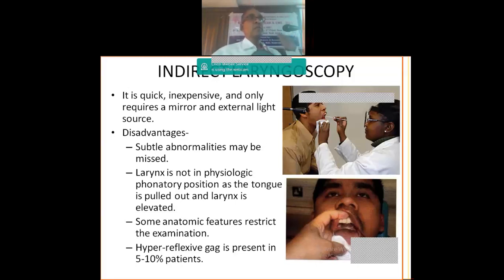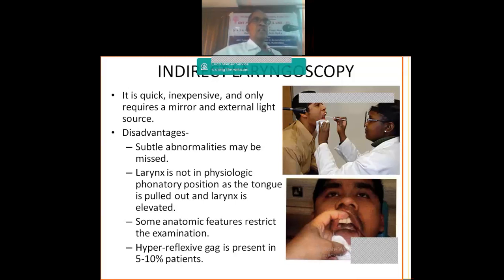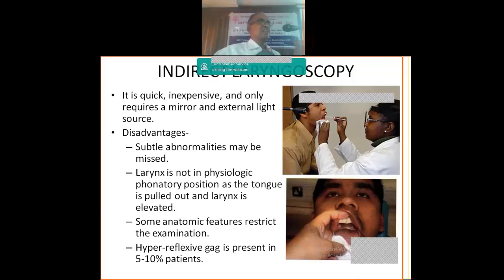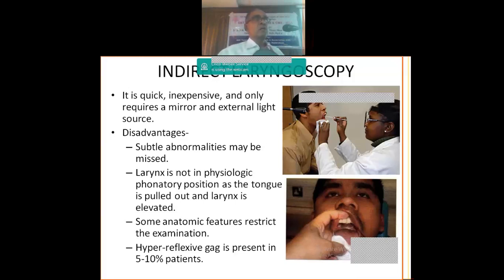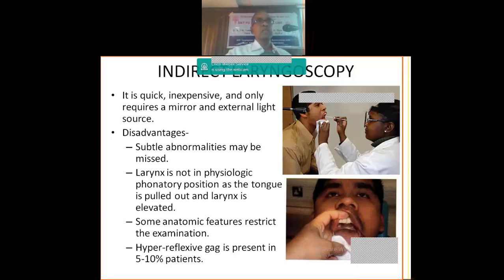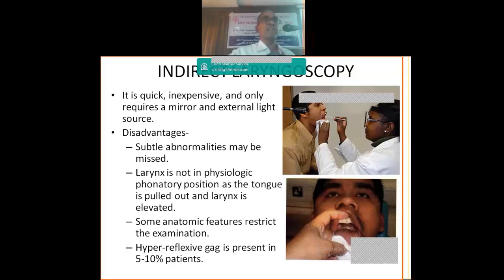So what is something wrong in that is, you see the upper lip, when you open the mouth, many patients' upper lip comes down. So it is better to use a finger to push it up. But be careful. In my initial days, when I didn't cut my nails, the patient scolded me because it hurt her mucosa. So we should have proper nails also for that. And before doing the examination, explain to the patient what you are doing. You just put the mirror into the patient's mouth, they will close. And when you heat the mirror, touch with the back of your hand whether it is ideal temperature or too much or too less. If it is too less, it will be foggy. If it is too high, they will shout at you.